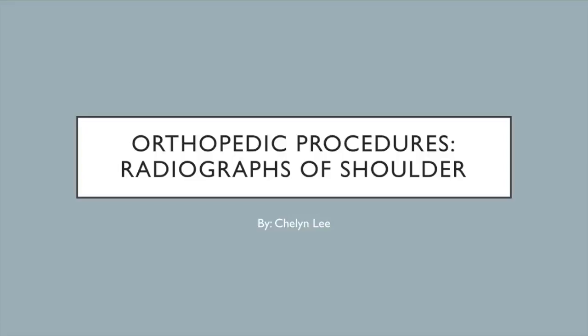The shoulder exam is considered to be one of the top 5 radiographic procedures where the staff at UNC facilities are most often making errors, either from positioning, patient safety, or image quality malfunctions. This learning module will explain how to thoroughly and successfully complete a shoulder radiographic exam in order to avoid these types of errors.